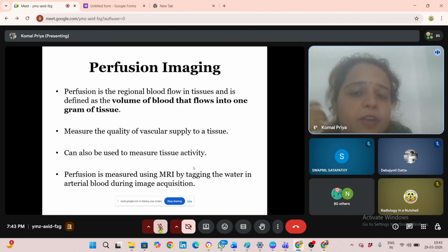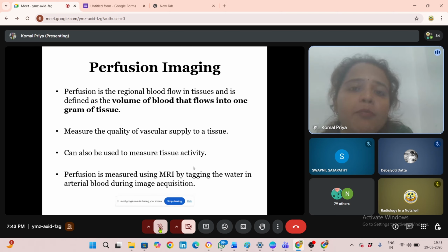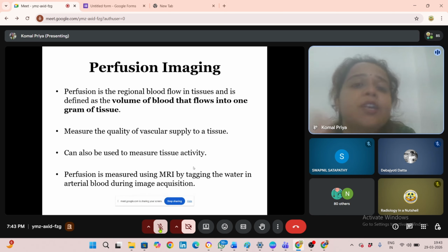It is important, because unless you are clear with the basic principle, which I tell in all my classes, you cannot read MRI very clearly and nicely. You'll love it. But if you're not clear with the basic principle, you will not understand functional imaging, because in each sentence, even in the textbooks and research articles, they mention a word that you have to refer back to the basic principle, the encoding, and the sequences, spin echo sequences, gradient echo sequences.